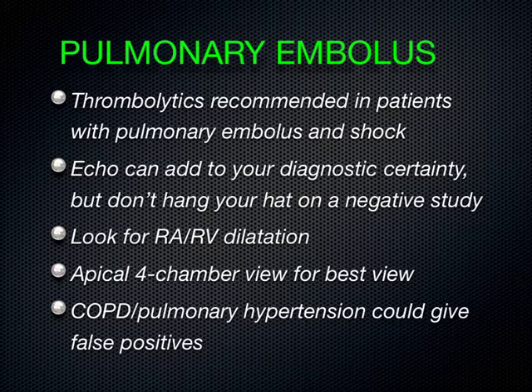So, we don't get a lot of patients with COPD at UC Irvine for whatever reason compared to other places where I've worked. And maybe there's just less smokers around Orange County than in other centers. I'm not really sure. But lucky for us with doing ultrasound of the heart, we don't have that confounder too much. But in the setting of COPD or pulmonary hypertension, you have to be very careful how you interpret anything with echo.